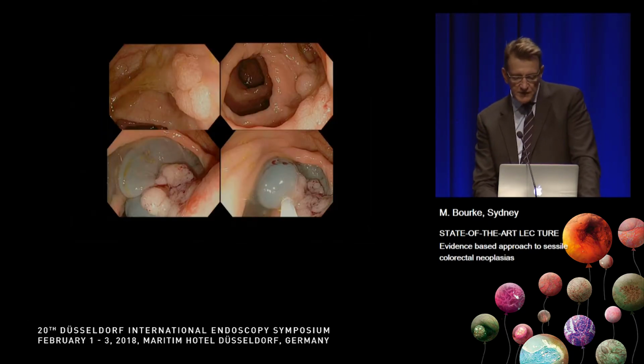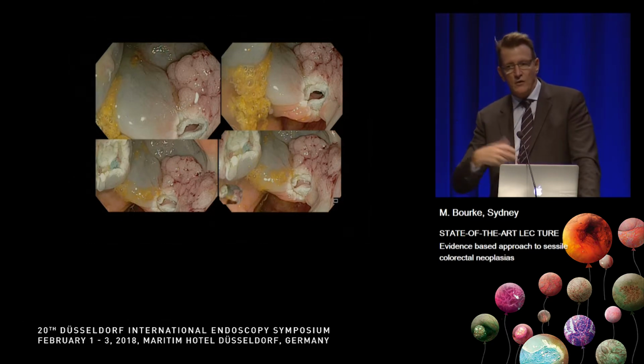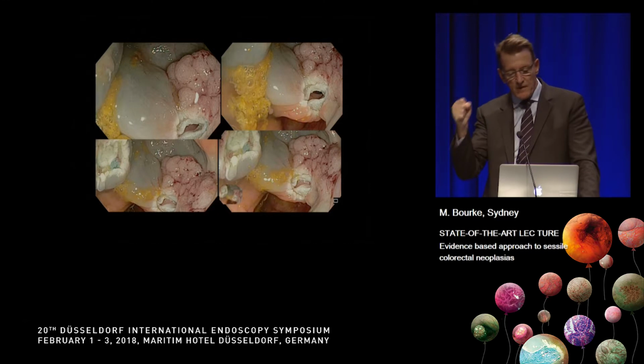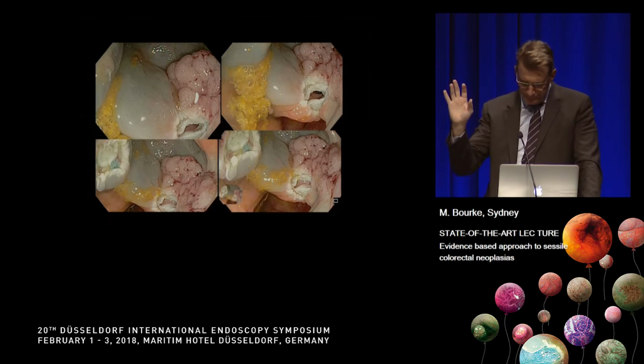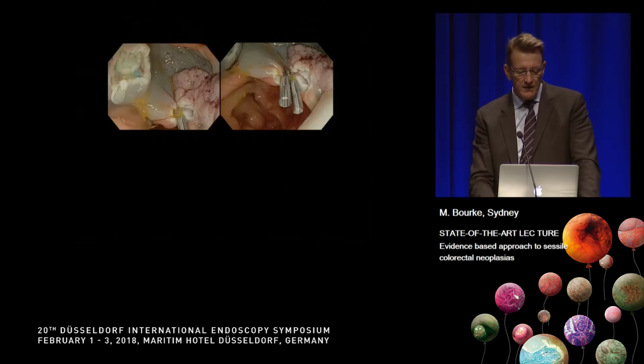So we have the obvious hole, which of course can be fixed up, and the risk factors for these events are in fact transverse colon location because of the intraperitoneal location of the colon, aspirating gas, and closing the snare, where sometimes you can capture the muscle. High-grade dysplasia or cancer is also a risk because of the desmoplastic reaction in the stroma, which sticks the muscle to the mucosa, and also attempted en-bloc resection. So if you really go for gold with the snare, you create a risk.